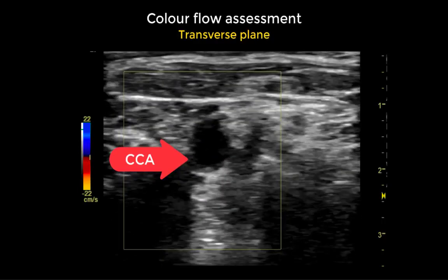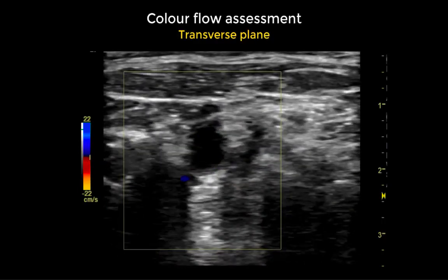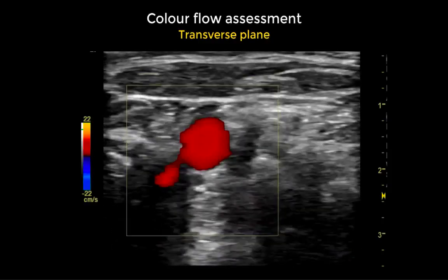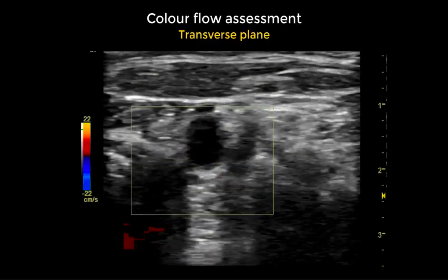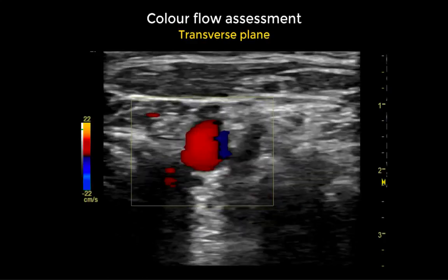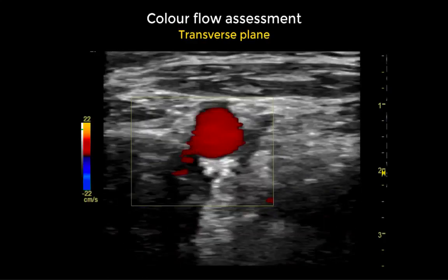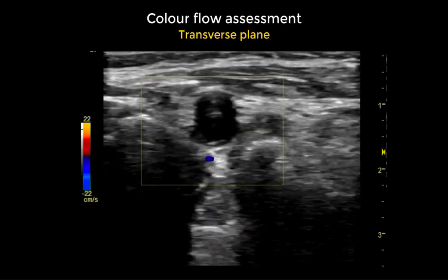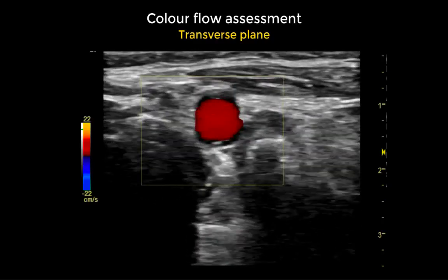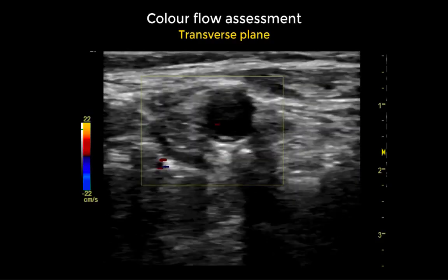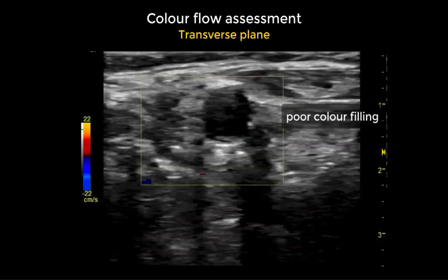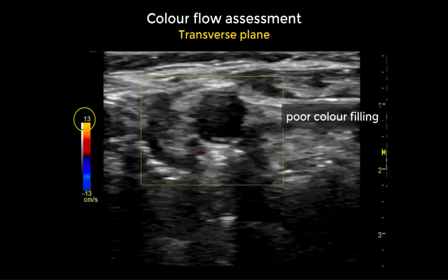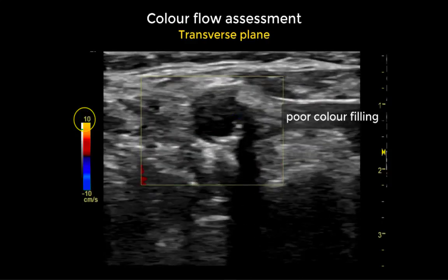We start the assessment using colour flow of the common carotid artery in transverse mode. We optimize the mode first, reduce the size of the box, keep the box straight, and begin assessment of the common carotid artery. We move the transducer up towards the bifurcation and note that there is not good colour filling despite lowering the scale.